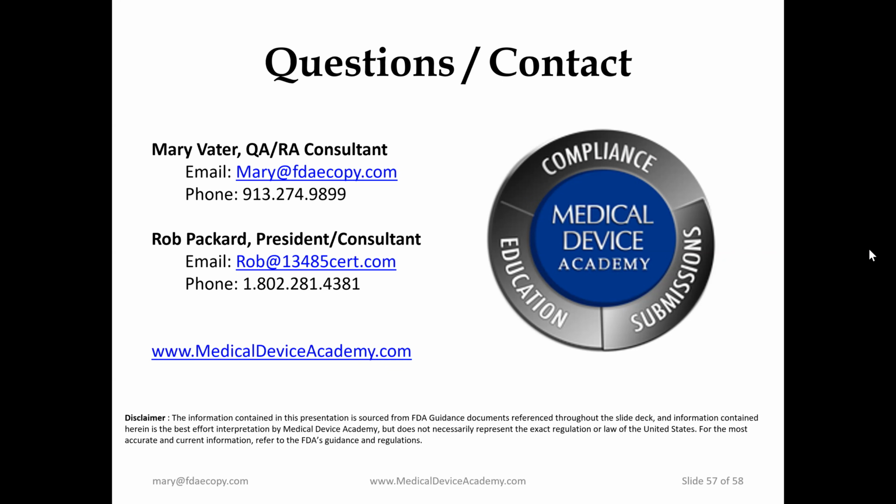One of the comments here says, good luck auditing Google or Microsoft. That is true, they're not going to let you come in and audit their software development process, even if you're using their software. However, you do have the ability to sign up for updates for any known cybersecurity issues and bugs that need patches.